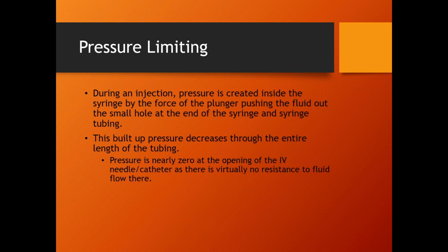Now, here's the thing too. We selected a flow rate of 5.0 milliliters per second. All right, pressure limited. My injector slows down, but maybe it only slows down like 4.8 or 4.7. I mean, we're not saying it drops down to 1 milliliter per second. We might still be able to use these images. So that's another reason why they don't shut the injector off. We're just gonna slow it down, see what we get. Maybe we're still good. All right, that's pressure limiting.